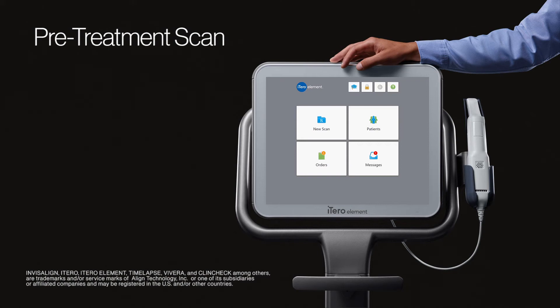It's easy to create a pre-treatment digital model of your patient's dentition prior to restorative procedures with the iTero intraoral scanner. Let's get started.